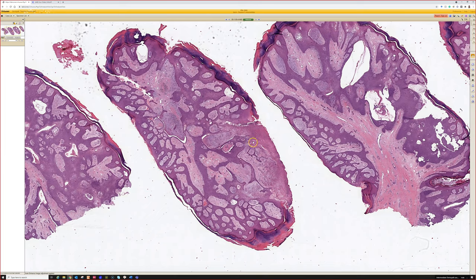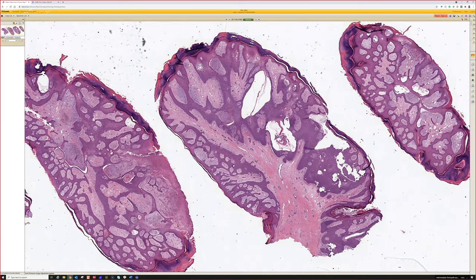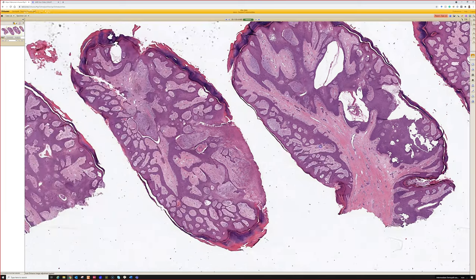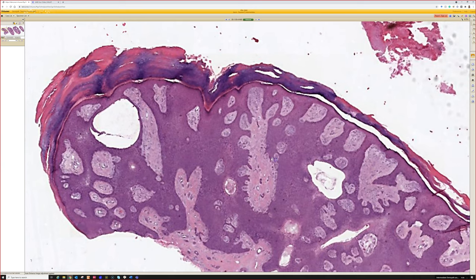Poroma from low power, you can see that the epidermis is dramatically expanded. You have these long fingers or tongues of bluish, blue to pink cells extending down, like the rete have gotten dramatically elongated and pushed down and kind of interconnected and anastomosed with one another. And there are multiple areas like that. Some people have likened this to a shower curtain or something like that, I can't remember the analogy. I guess so, if that works for you.